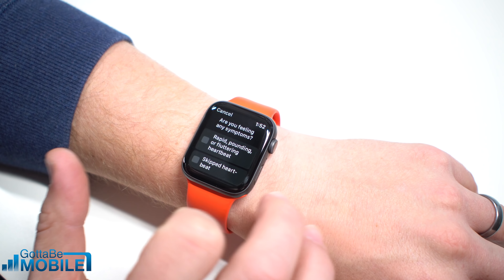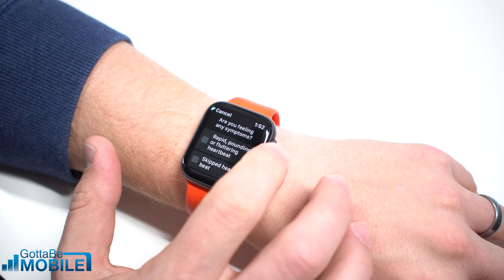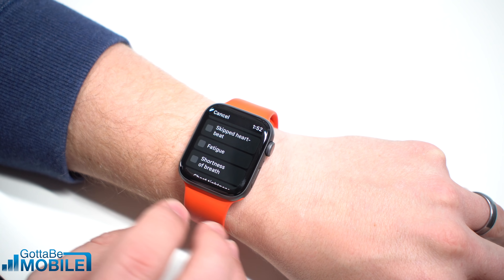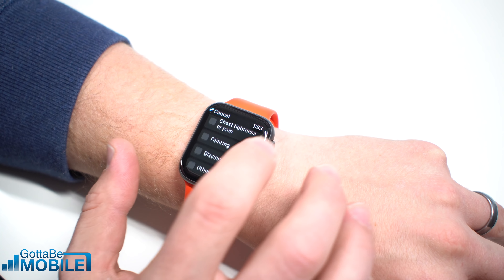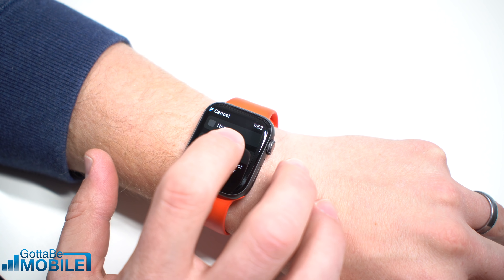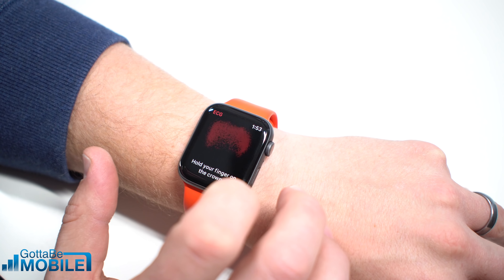If you're not feeling great, you can add symptoms right now about how you're feeling, and this will all be logged with this ECG. So if you go to a doctor, you're going to be able to let them know how you were feeling at that specific time. And when you hit save, it's going to save, and then we hit done.